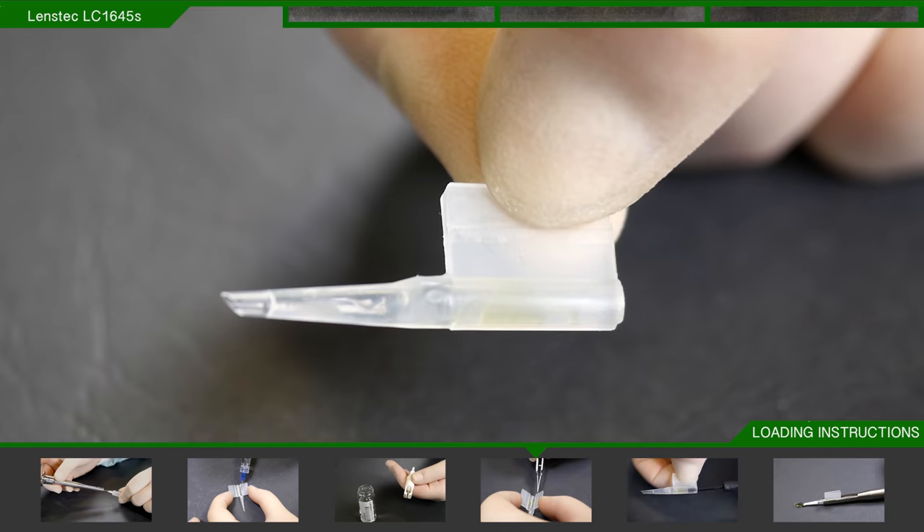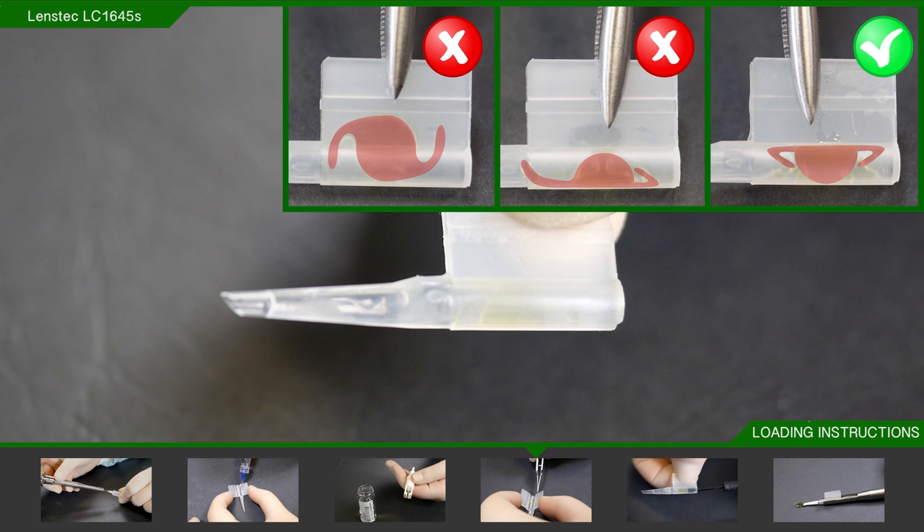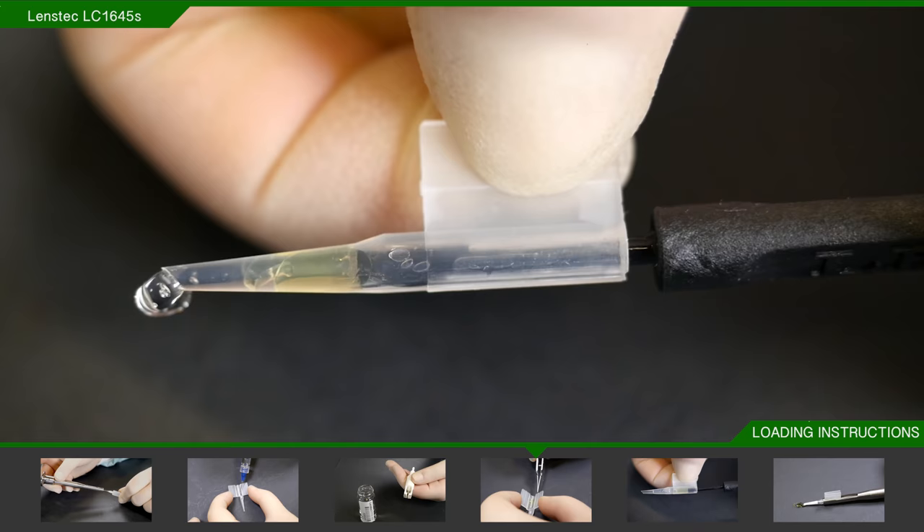Then remove the forceps and quickly close the cartridge. Hold the cartridge by the flaps from above and check that the lens is folded neatly inside, that the haptic is not straightened, and that there is no part of the lens trapped in the flaps. Using the lens advancing aid, push the lens from the chamber into the barrel of the cartridge.